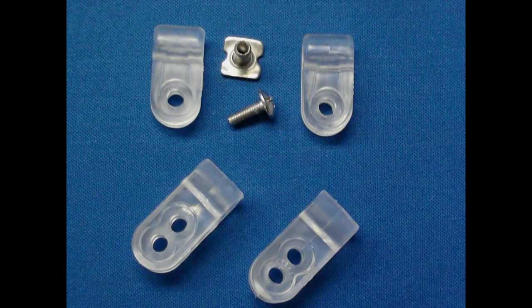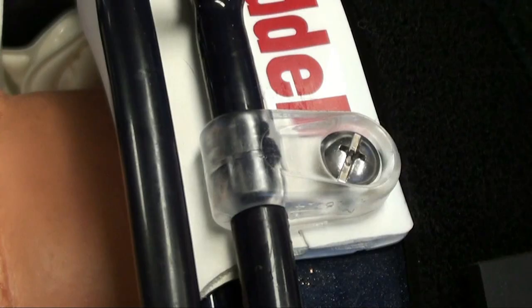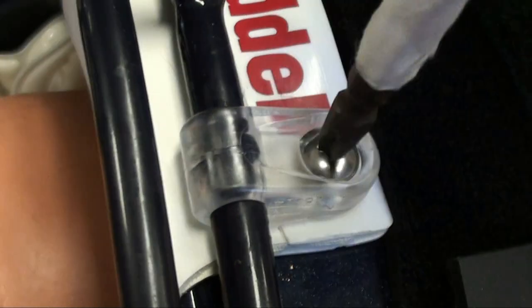The forehead fasteners on the Revolution football helmet resemble smaller, less bulky versions of more traditional loop strap fasteners. This makes them quite easy to cut using the same FM extractor techniques for cutting through traditional forehead loop strap fasteners in the event that removal using a power screwdriver is unsuccessful. There are two techniques for cutting the Revolution forehead loop strap fasteners using the FM extractor.